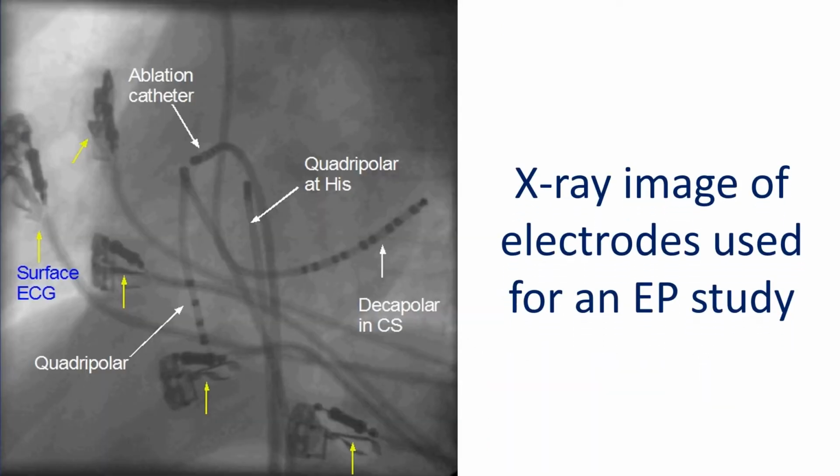An electrophysiology study, EP study, is done prior to RF ablation to identify the source and mechanism of the abnormal electrical activity or conduction within the heart which causes the heart rhythm abnormality. EP study uses multi-electrode wires introduced into the heart chambers under local anesthesia through the blood vessels of the neck and groin. A repeat electrophysiology study is usually done after the RF ablation to make sure that there is no likelihood of recurrence of the heart rhythm abnormality.